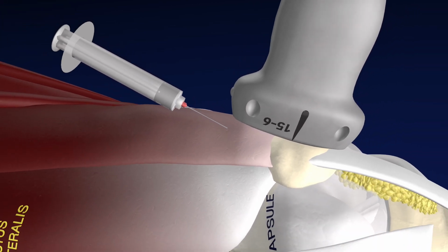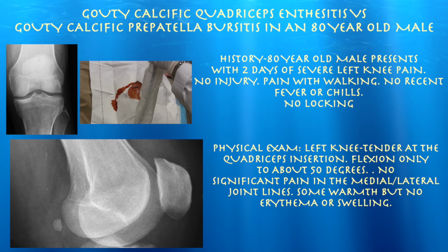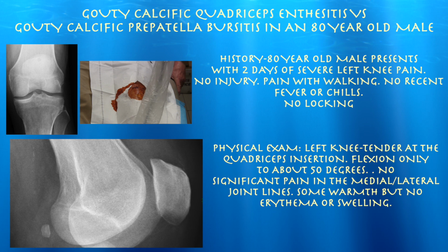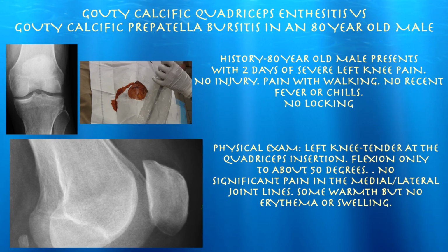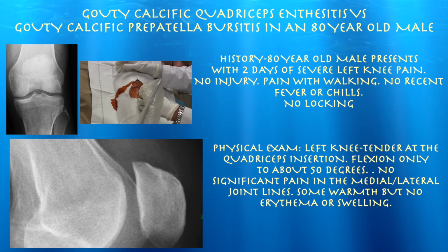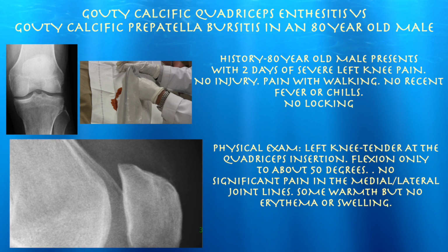And here's our tendon. You can see it's somewhat red relative to the other tendons, consistent with some tendinosis and irritation. This is our patient, an 80-year-old male, here for severe pain in the left knee for a couple of days, no injury. X-ray just shows minimal osteoarthritis medially. He's just very tender at the insertion of the quad tendon. That's really the main finding on physical exam. Besides that, it's also difficult to flex beyond about 50 degrees.